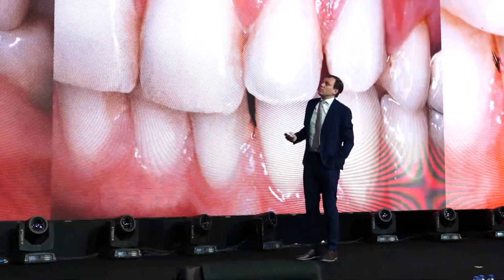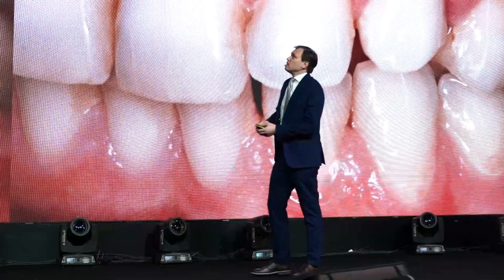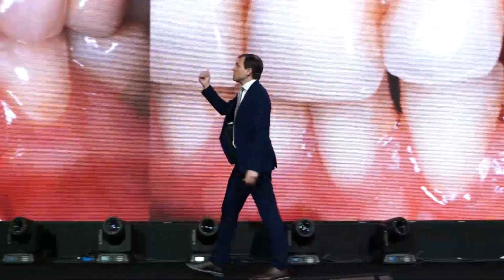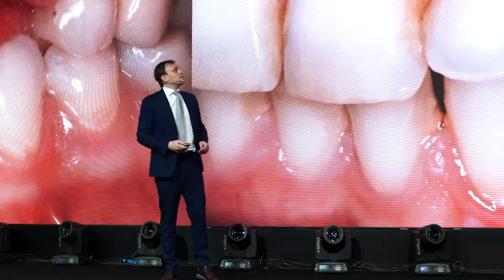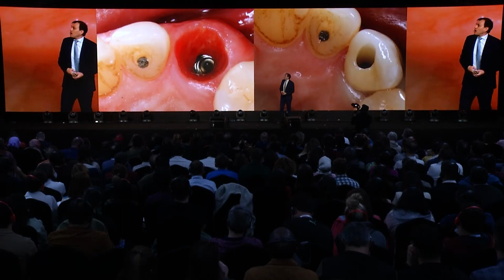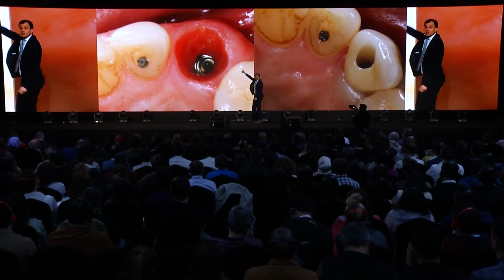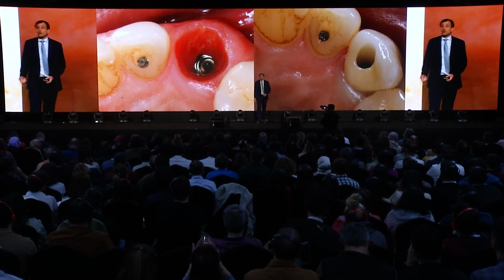In immediate implants, a very nice situation: extraction of the canine, then implant placement and the provisional restoration. I have, again, sufficient height of the tissues. So what? I just do a super polished zirconia crown.